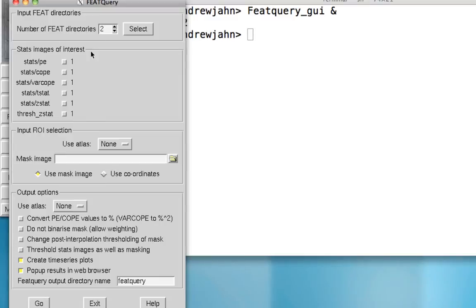Once you have those, you're asked what stats do you want to extract from that region. In this case, let's just extract the parameter estimate for both of those contrasts.